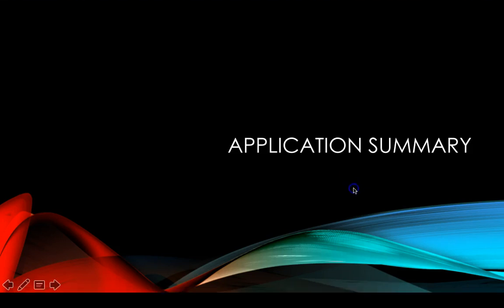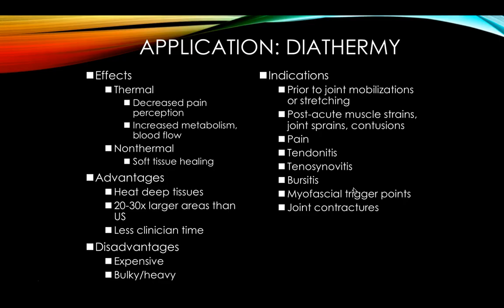Okay, so to wrap up our diathermy conversation, we'll do our application summary. So again, this would be if we had a competency, right? This is kind of the steps you would have to go through. So the effects that we get with diathermy, we can have the thermal or non-thermal.